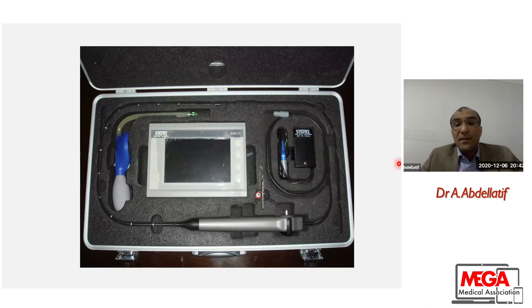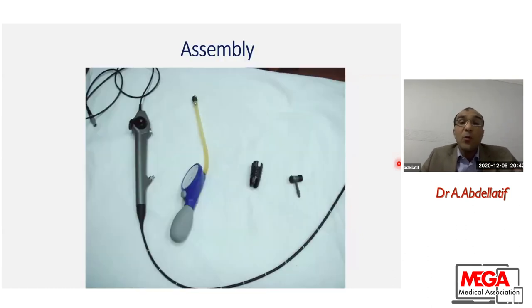It's very important before using the fiber optic on a patient that I have to be familiar with my device. So I have to learn how to assemble my device. The assembly here, this is the fiber optic. This is the leakage tester. This is the tube holder, and this is the suction port.